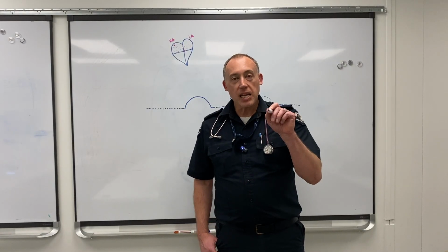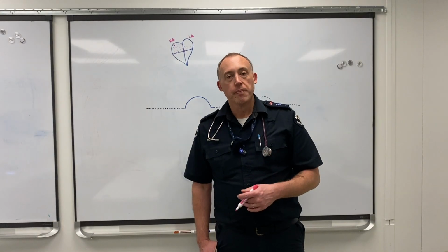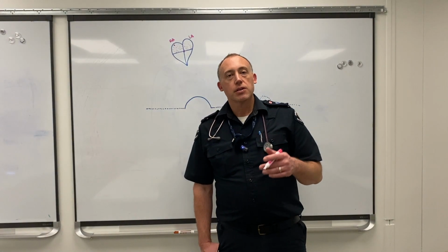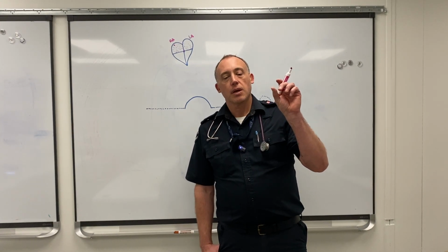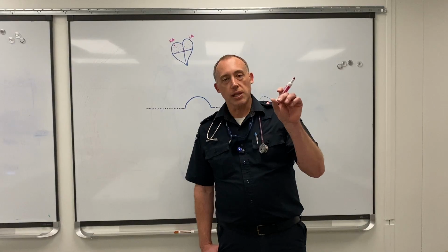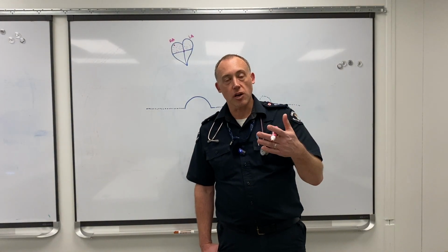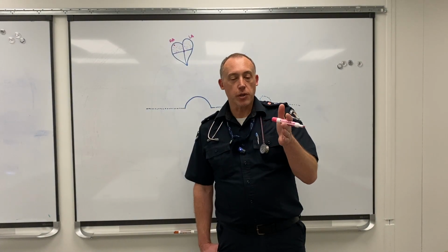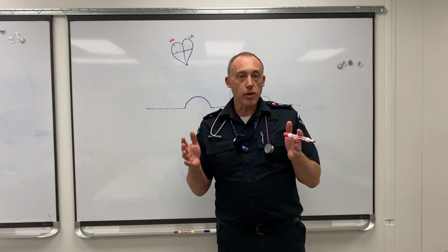The little tiny boxes in between represent 40 milliseconds, or 0.04 seconds, sorry. So you can guess the length of time that something is taking, like the P wave or the QRS complex, by measuring how many boxes that certain deflection or wave goes over.